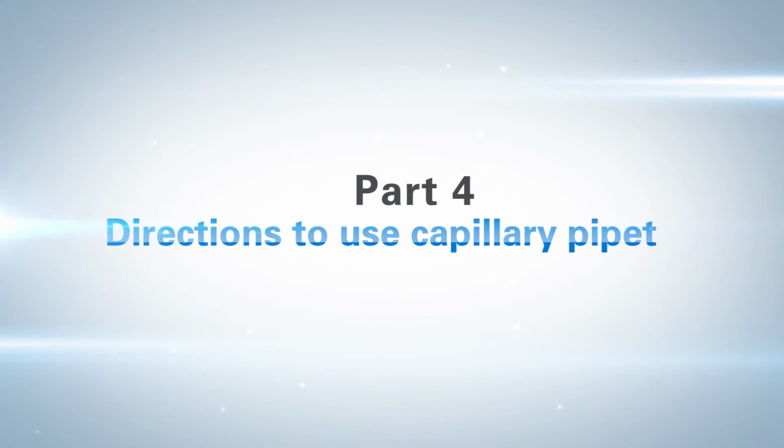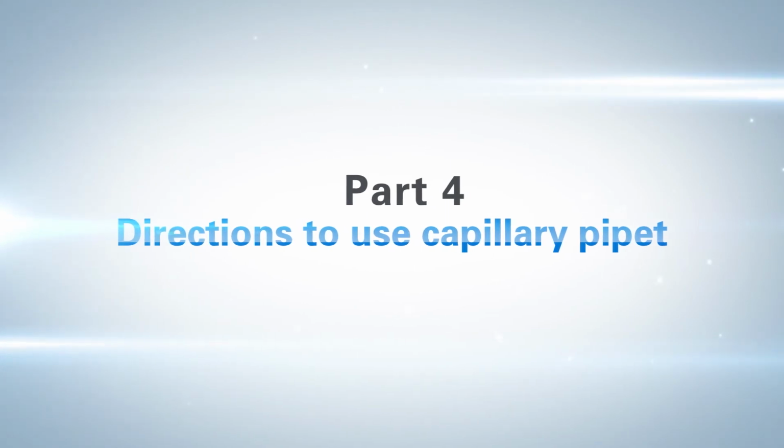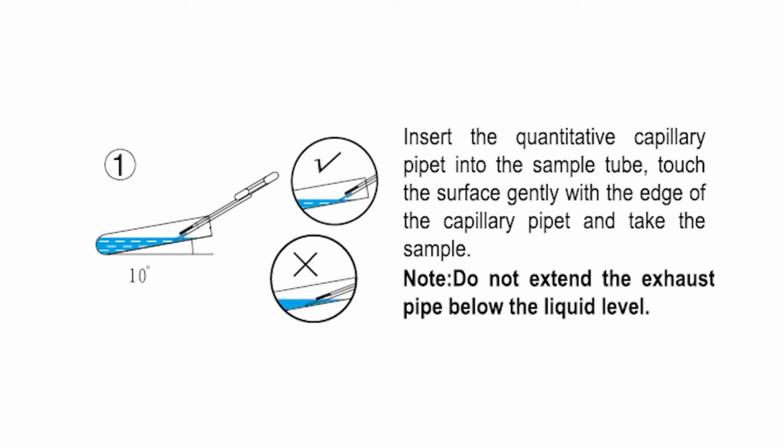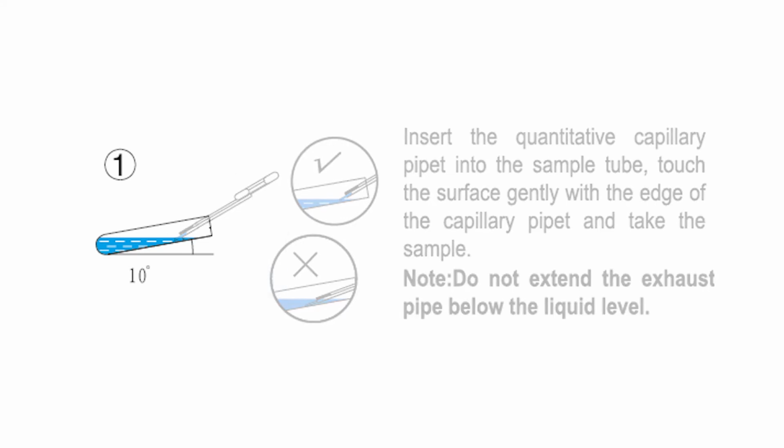Part 4. Directions to use capillary pipette. Insert the quantitative capillary pipette into the sample tube. Touch the surface gently with the edge of the capillary pipette and take the sample. Note: do not extend the exhaust pipe below the liquid level.